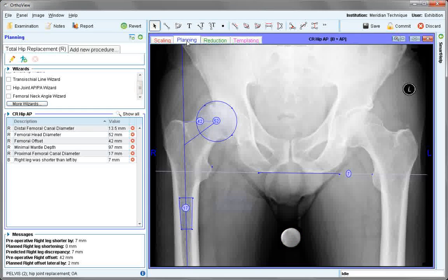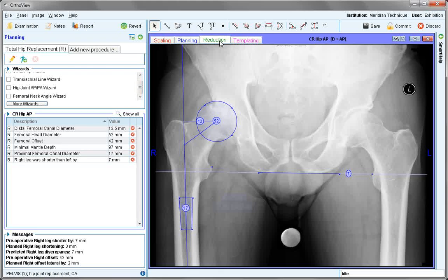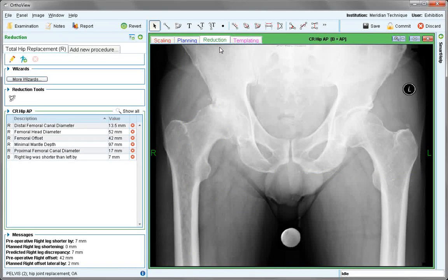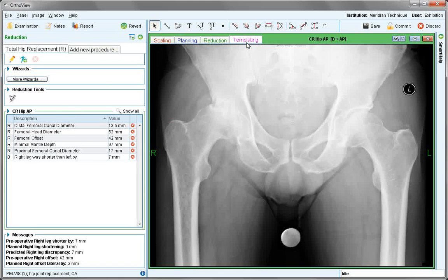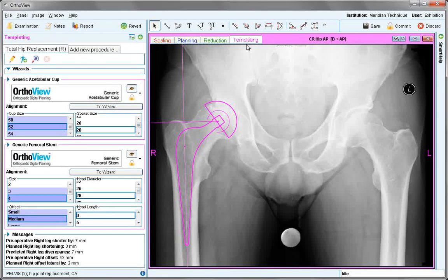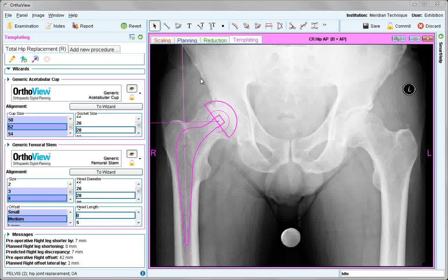The next tab is Planning, where wizards and tools exist to assist you with making measurements and calculations for particular procedures selected. The Reduction panel is presented in trauma procedures and allows segments of bone to be realigned. The Templating panel, which will be available for most elective procedures, is the final stage and allows positioning and sizing of the template.